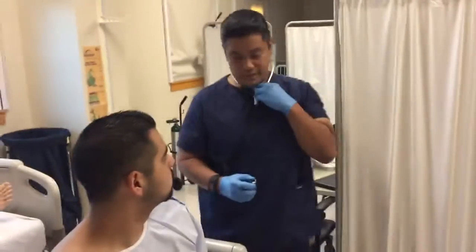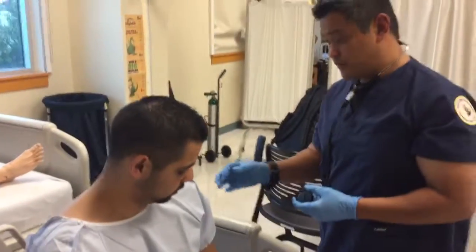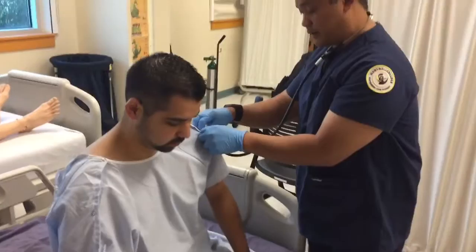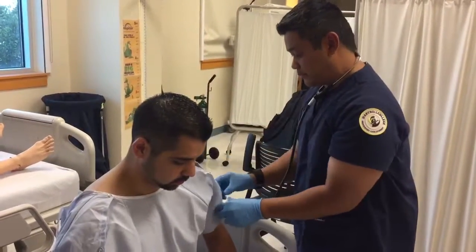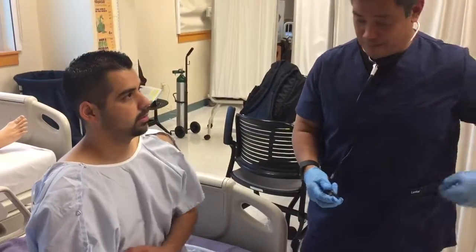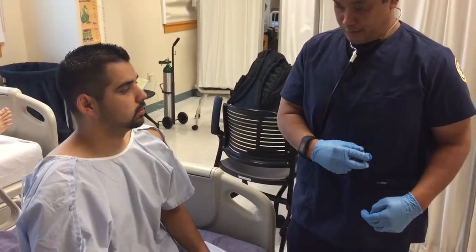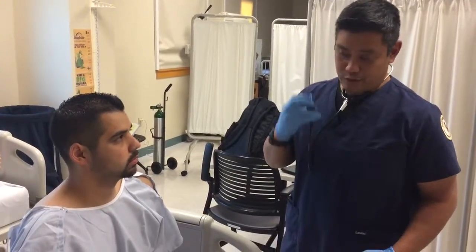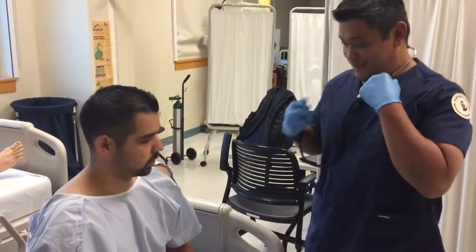All right, thank you, Christian. And we'll be basically doing the same thing in the front. If you don't mind, I'm going to go ahead and open up your gown a little bit, just so we can get to the points that we need to. We'll be starting from the sides, and then from the center, going from one side to the other, and also listening to your throat in the end. Okay, thank you.